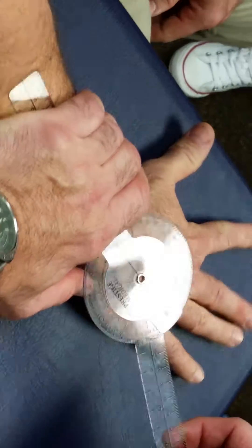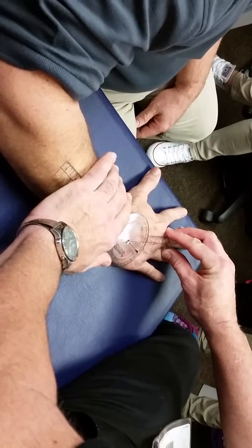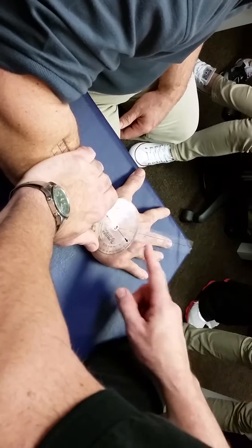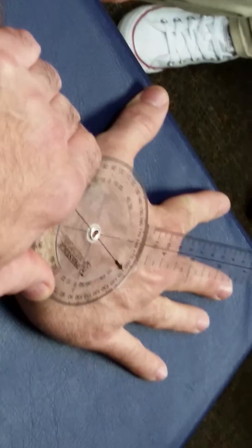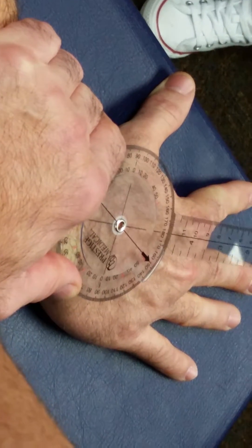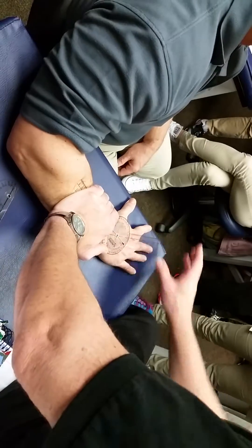Now go towards your thumb. So he's going to go there, and I'm going to find that and be parallel with it. Because if I went actually on it, look at where my axis moved. So I'm going to be parallel with that, and I'm going to measure — and he has 28 degrees. Similar to the ankle, we found that we went inversion farther than eversion; you're going to find that you go farther ulnar deviation than radial deviation. So that's how we're going to measure it.